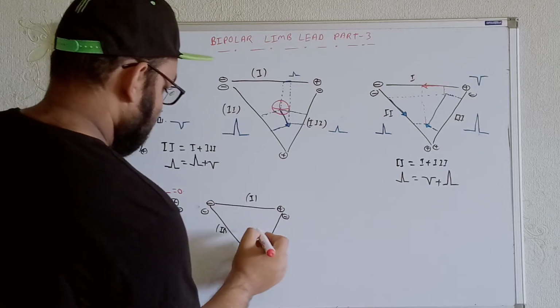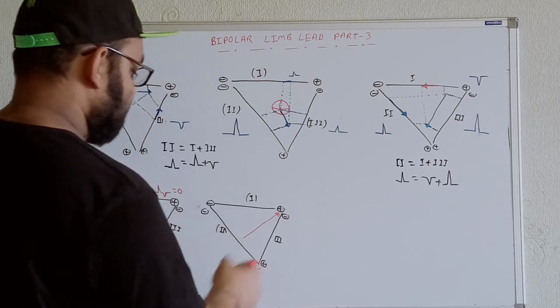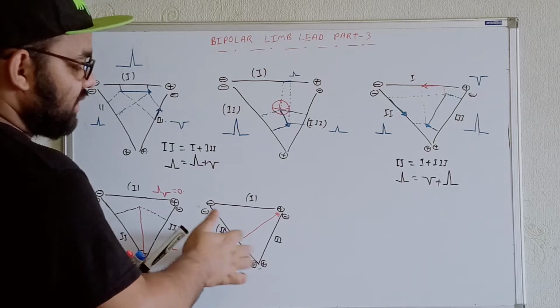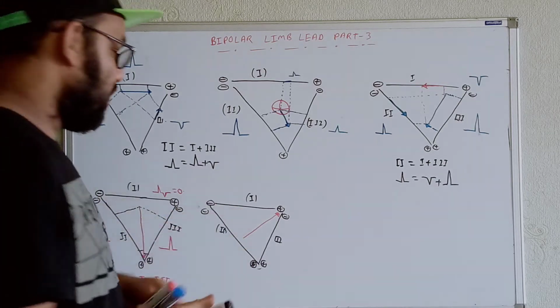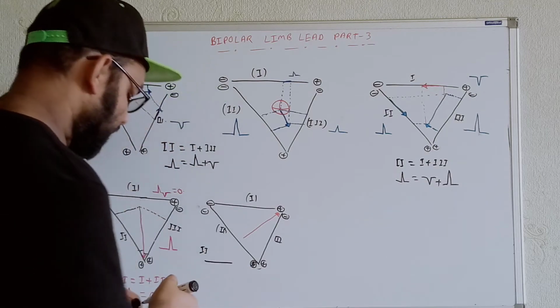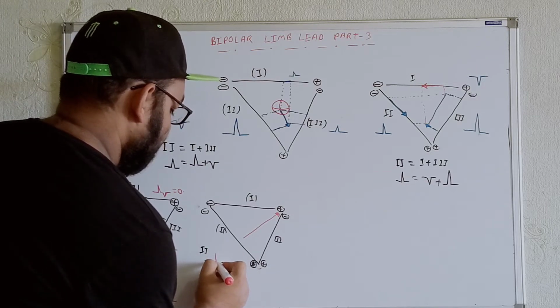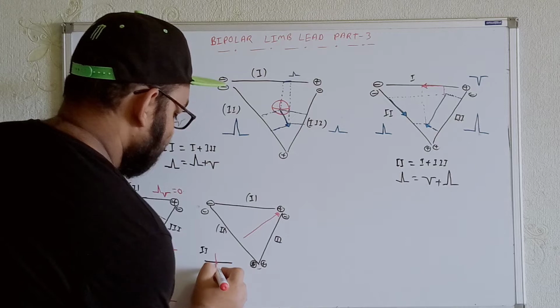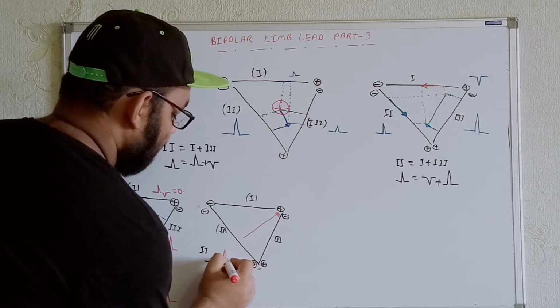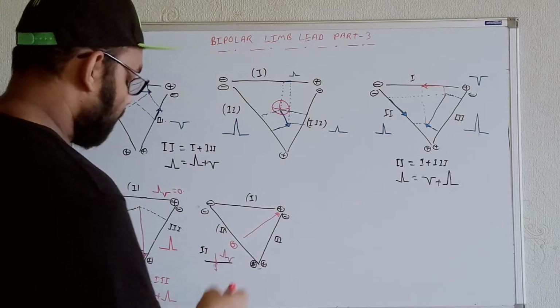For example, that is going in these directions. So whenever it will go in these directions, try to understand. Definitely, for lead number 2, the direction of the major ventricular depolarization is perpendicular. So if I just draw lead number 2 over here, at first, it is coming, it is touching, and it is going away. Whenever it comes, at that time we will get the positive deflections. Whenever it touches and goes away, after that again we will get the negative deflections. So the result we will get is zero potential difference over here.